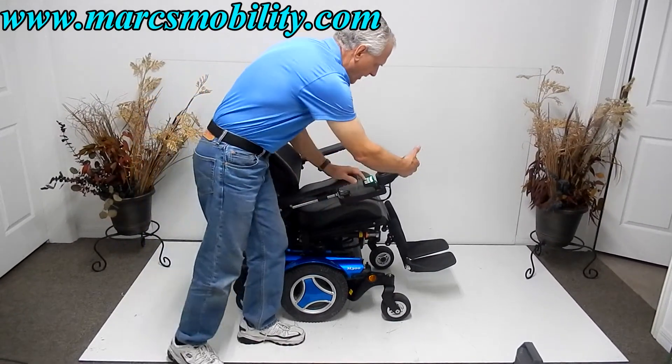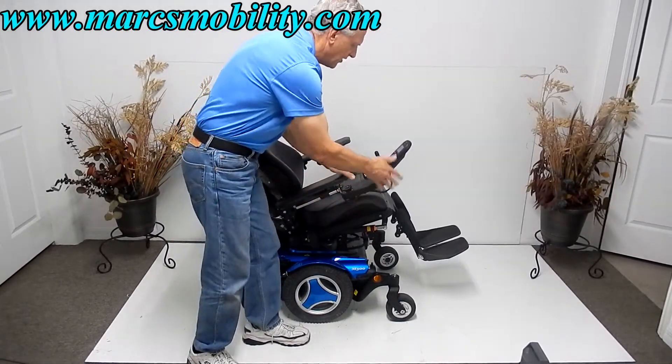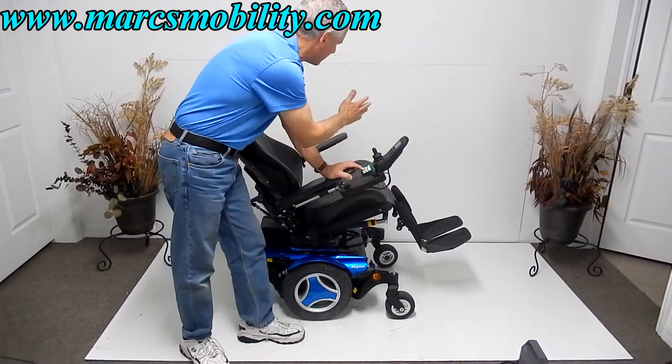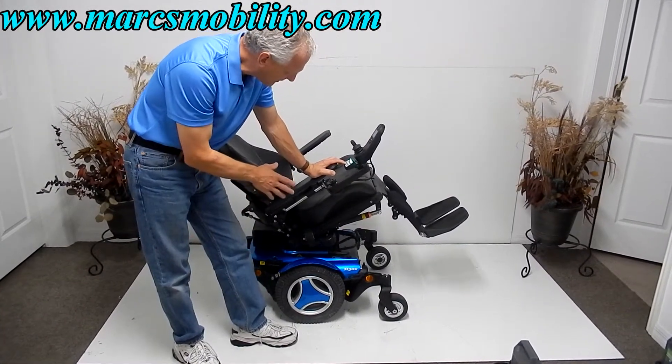This chair also has a swing-away joystick. The joystick can be put on the right-hand side or it can be transferred to the left side if you're a left-handed person. It does come with a safety belt.